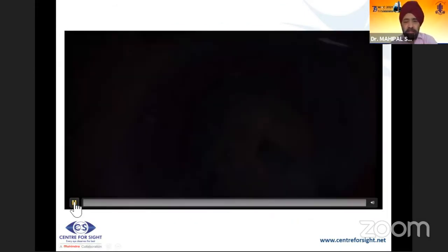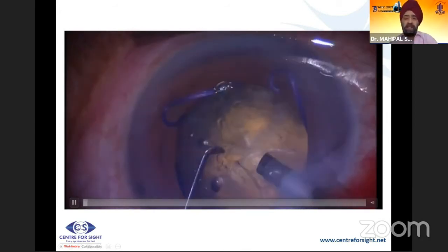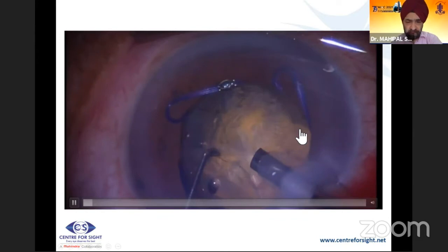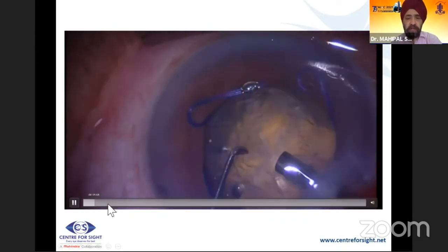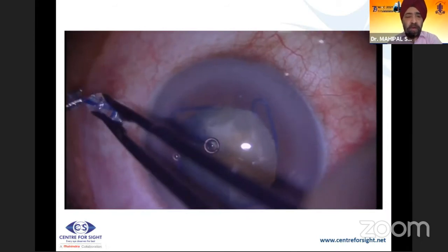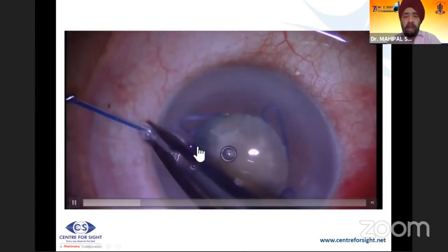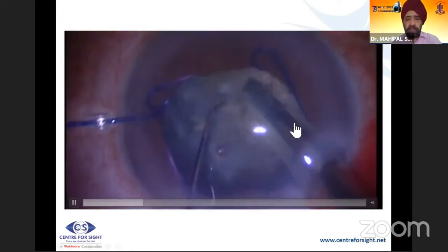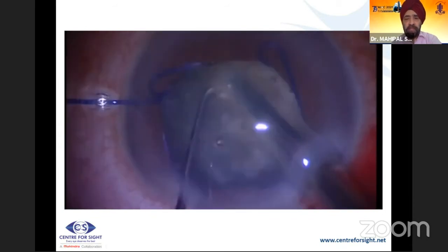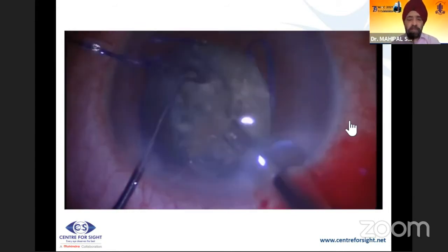After the femto procedure, you can see the Malyugin ring in place. Hydrodissection needs to be gentle and the nucleus should not be rotated forcefully. There is stickiness because hydrodissection was incomplete, and pre-chopping has been done. It's better to use capsular hooks here; iris hooks are being used to hold the capsule in position. With a pre-chopped nucleus and the capsule supported, the amount of manipulation to remove the nucleus is much less.